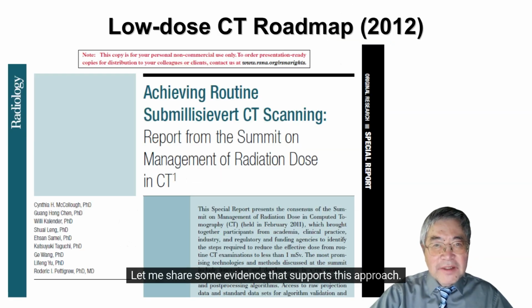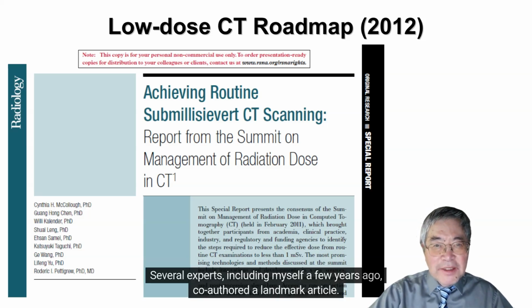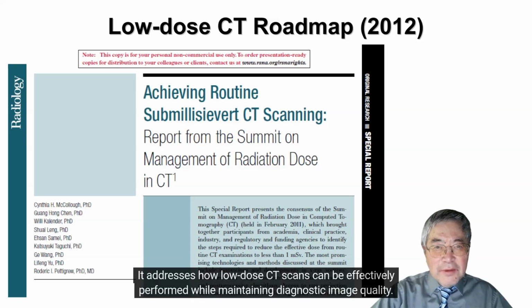Let me share some evidence that supports this approach. Several experts, including myself a few years ago, co-authored a landmark article. This article mapped out strategies and technologies aimed at achieving routine submillisievert CT scanning. It addresses how low-dose CT scans can be effectively performed while maintaining diagnostic image quality.